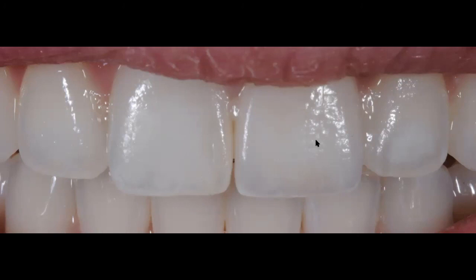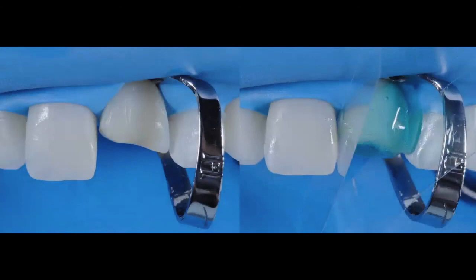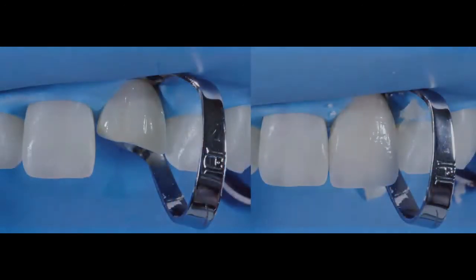So I need to have a technique, a system. And in this particular case, I had a system. What was my system? Number one, the Rite-Light. Number two, my composite. I knew that my composite had matched the value of the natural teeth very well. So why not fabricate a composite tooth and send it to the lab, so they can have it right next to them and use it at the time of shade matching the final restoration? So all this information I gave my lab, and obviously the cross polarized photos with all the information related to that incisal third. Now I'm just ready to bond, and I go through the bonding steps.